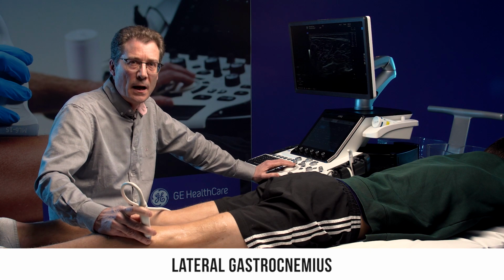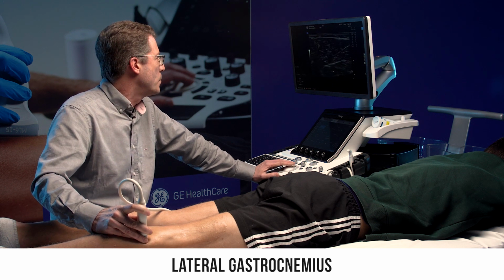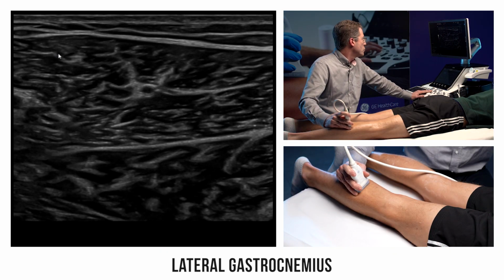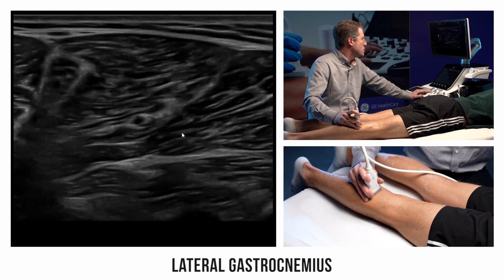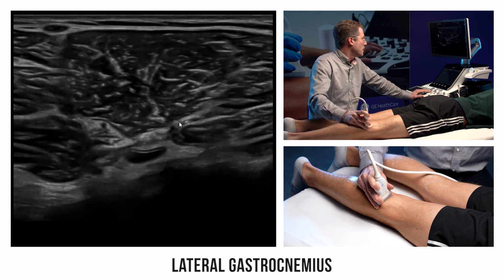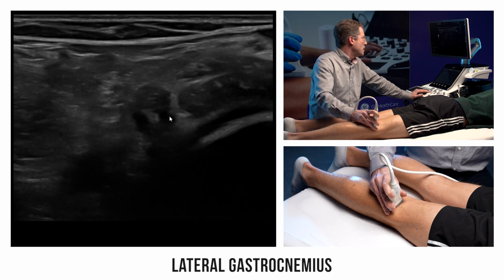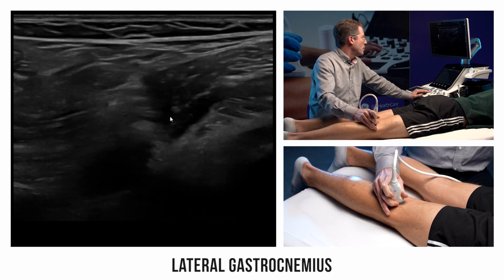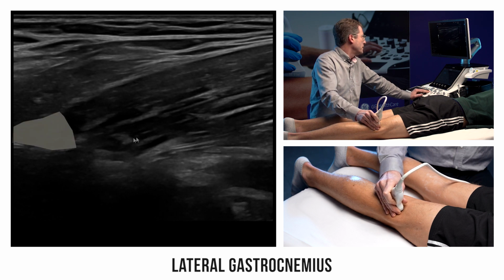More distally, we can analyze the lateral gastrocnemius. Still on an axial view, we can locate the muscle belly in the upper third of the calf. Then, we can slide the probe upward until we reach its condylar insertion. This insertion is better seen with a sagittal view if we rotate the probe 90 degrees.